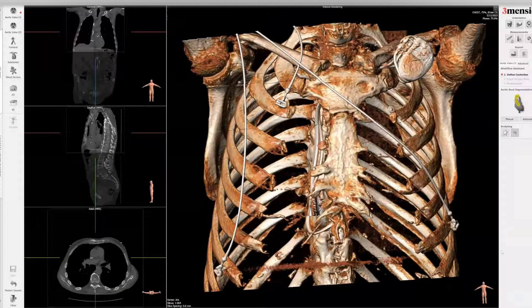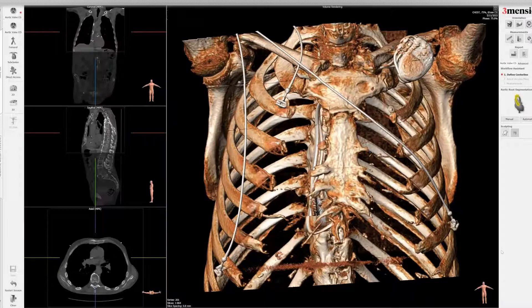Hello, today I'm going to show you a Fremenio workup on TAVR in a patient with advanced kidney disease, such that a contrast CT could not be done. As a result, a non-contrast CT was performed. So I'm going to show you how we can do a TAVR workup based on a non-contrast CT.